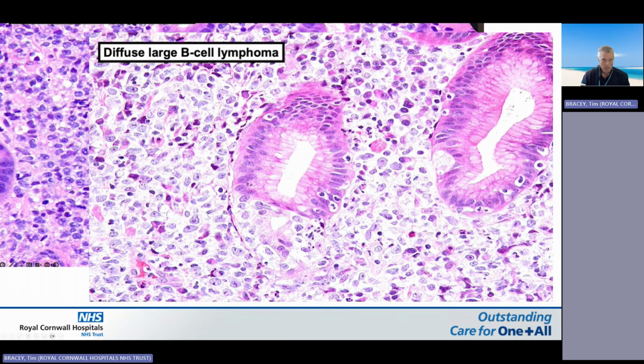This is from Jason Hornick, showing a really prominent clear cell appearance. And I think in this kind of case, personally, I'd want to do a cytokeratin as well, just to make sure it's not carcinoma.